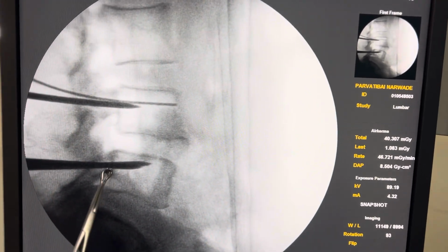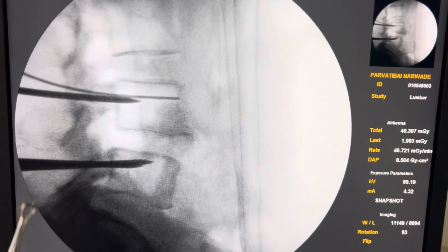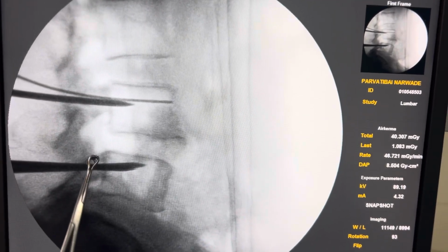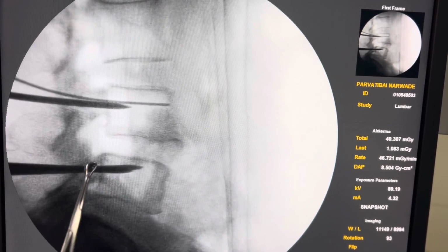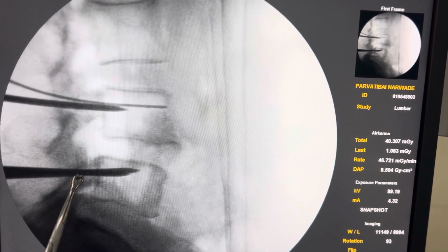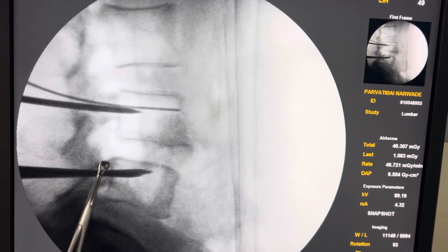The other way around, if in AP view the guide wire or needle is at the medial border of the pedicle, and in lateral view it is in the pedicle only, not entering the body, that means one needs to decrease the medial angulation and reach the body, so that one does not break the medial wall of the pedicle.